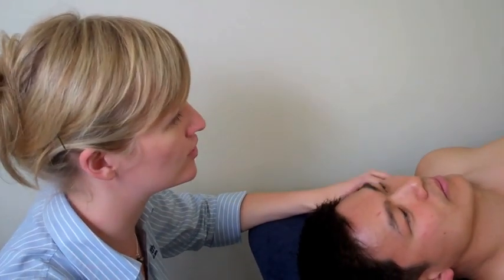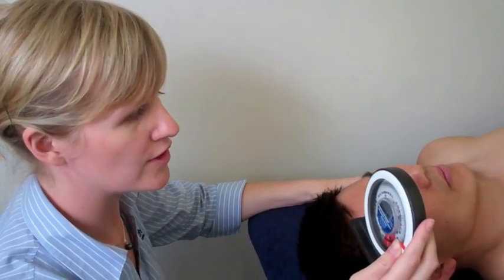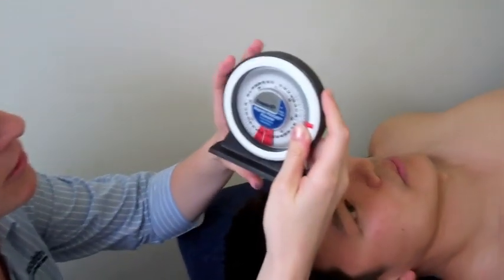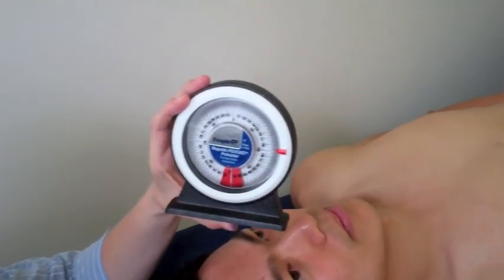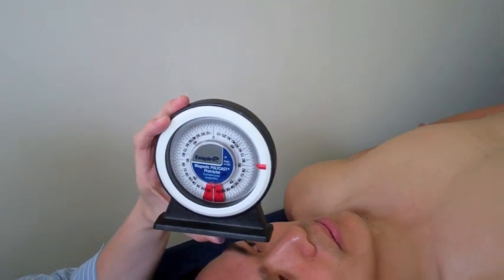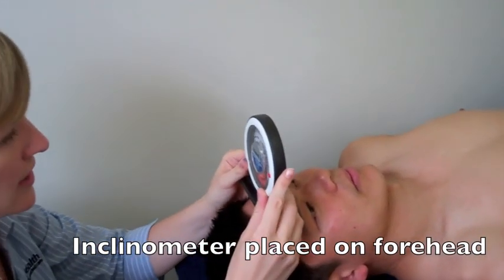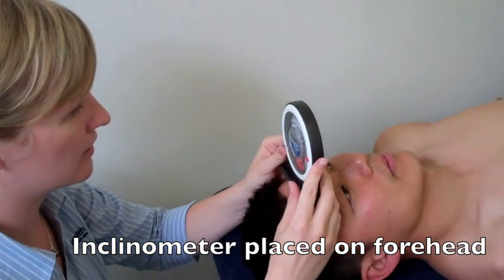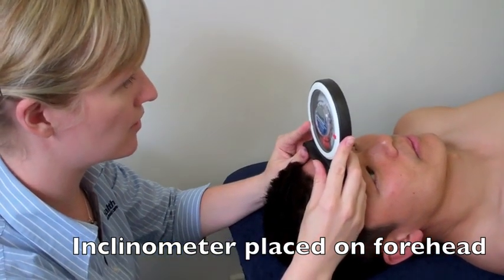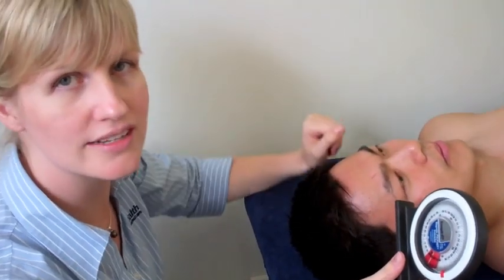So I'm going to go through the cervical rotation test to assess for cervical mobility in ankylosing spondylitis patients. First thing we need to have is an inclinometer, and what this does is measure the amount of degrees for which the neck is rotating. We place it on the patient's forehead so that it's sitting at zero, making sure that the patient is looking straight ahead to start off with.